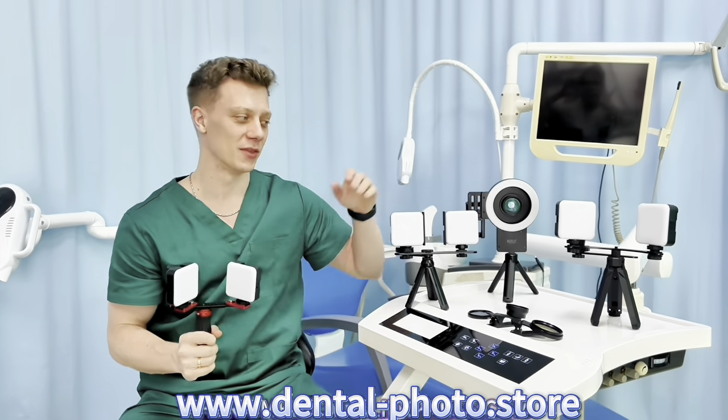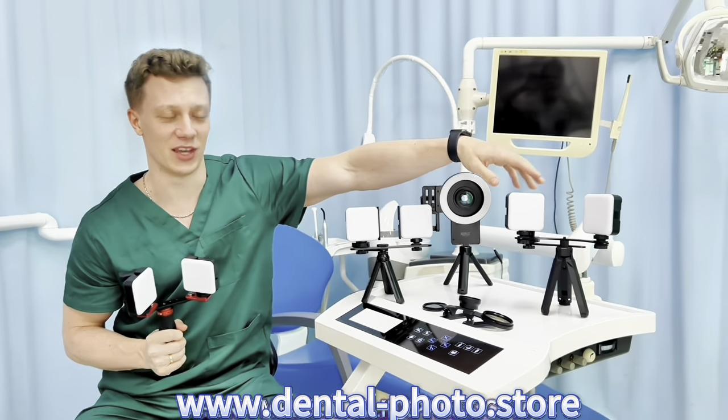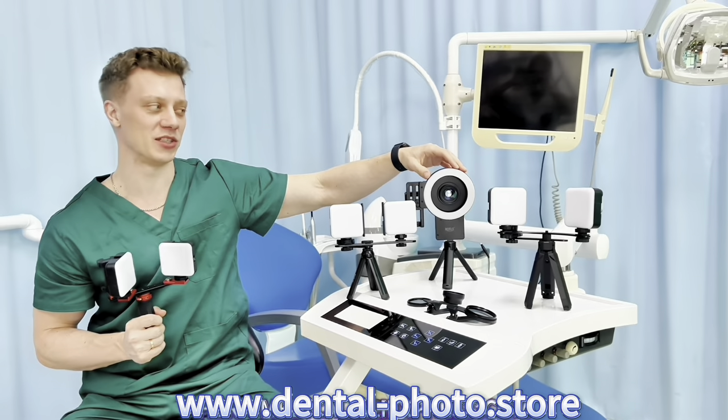This is the MK16, this one is the MK17, this is the MK19, and the MK23. If you don't know how to choose, you can always ask me.